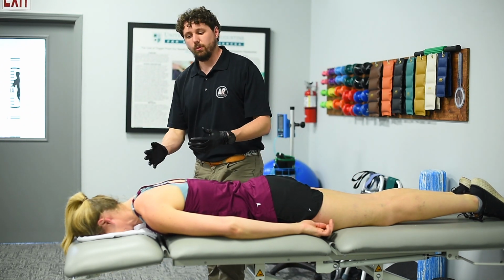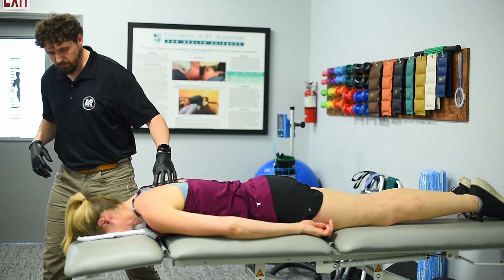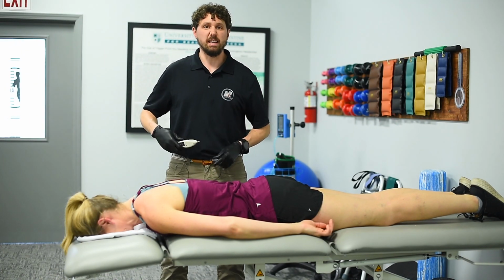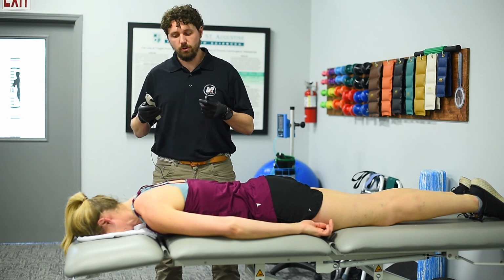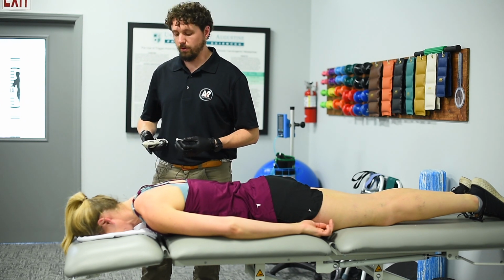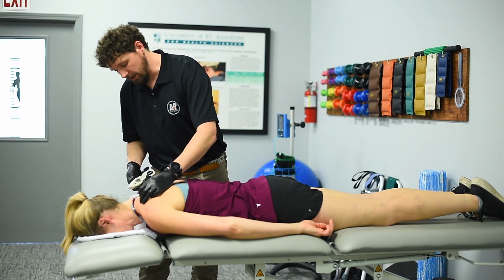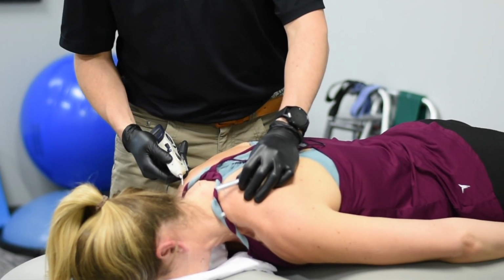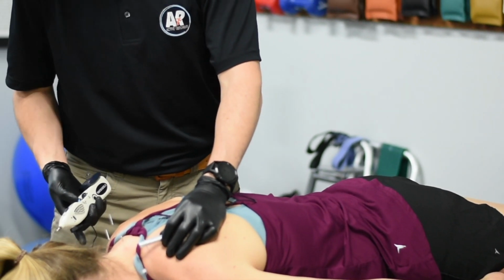Typically once I have those in place, I might use some form of stim. I have two different kinds, and I'll show those to you. If you've ever had an e-stim machine in therapy, this is kind of like that. It sends a little bit of electrical current. It's going to make those muscles jump and twitch just a little bit. It should be comfortable, shouldn't be sharp or any discomfort. We start low and find two different needles, point to point. We'll say, okay, you feeling anything there? I'm jumping, okay. So I start out really low and build up.